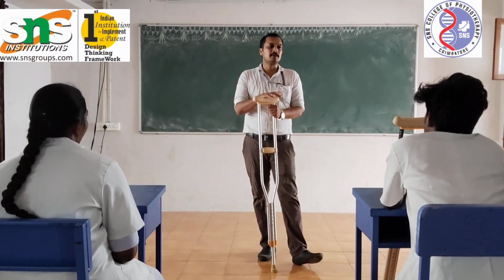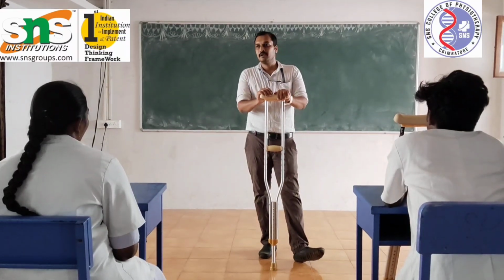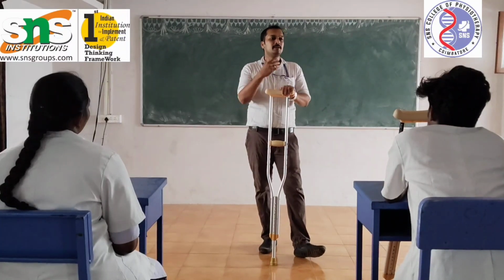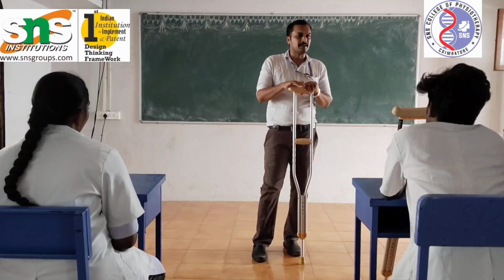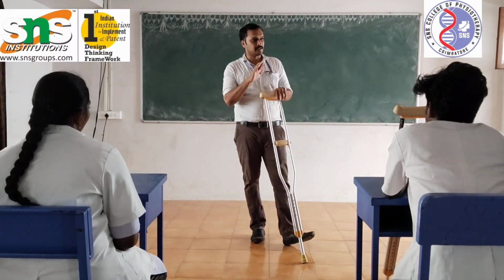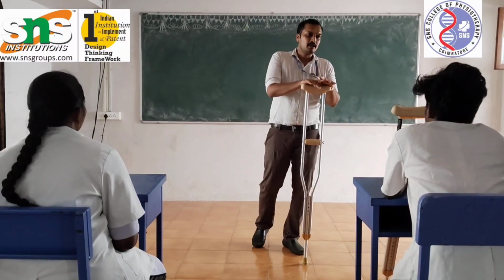So when will we go with lying and when with standing? If the patient is able to stand, we can go with standing. If the patient is not able to stand, we can go with lying. Okay, these are the ideal positions for measuring the crutch size. Next, we can measure the axillary crutch with shoes and without shoes. Yes or no? Okay.